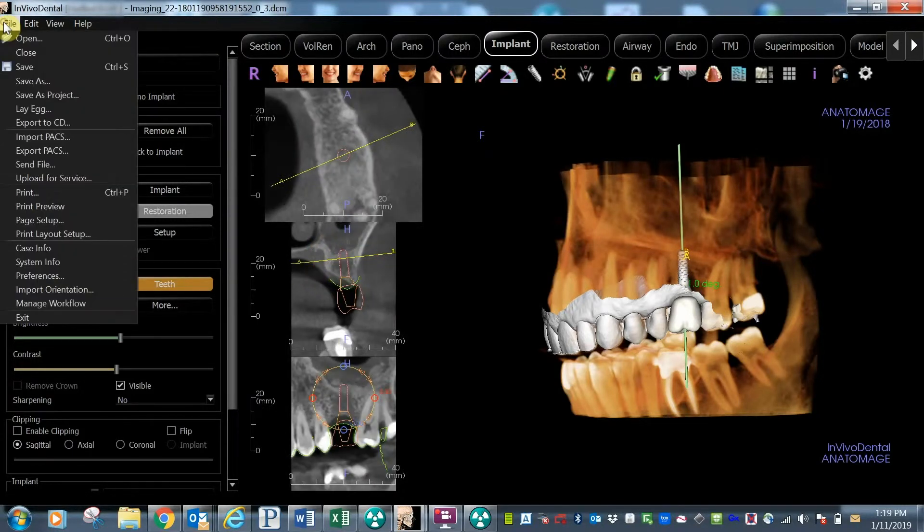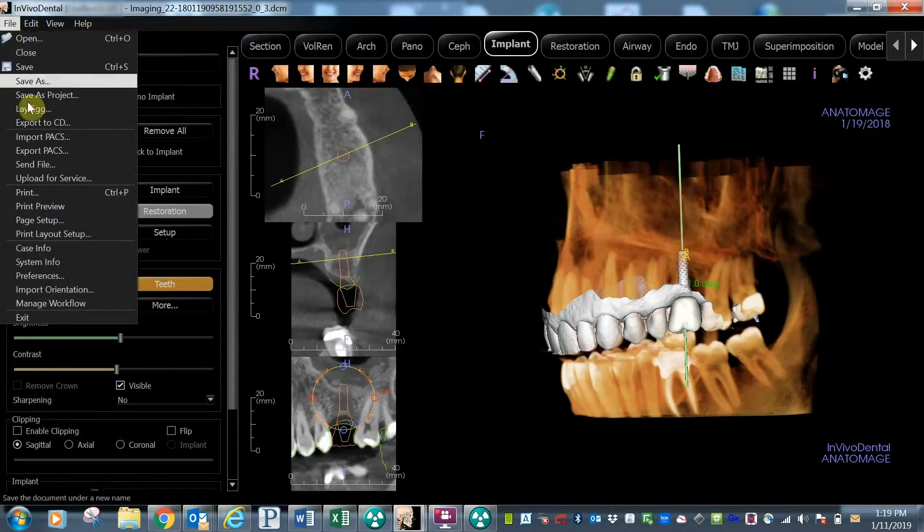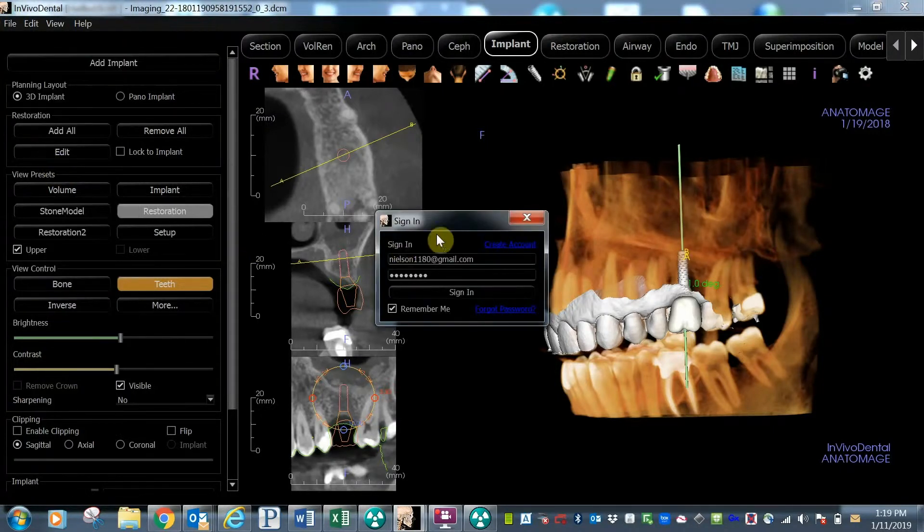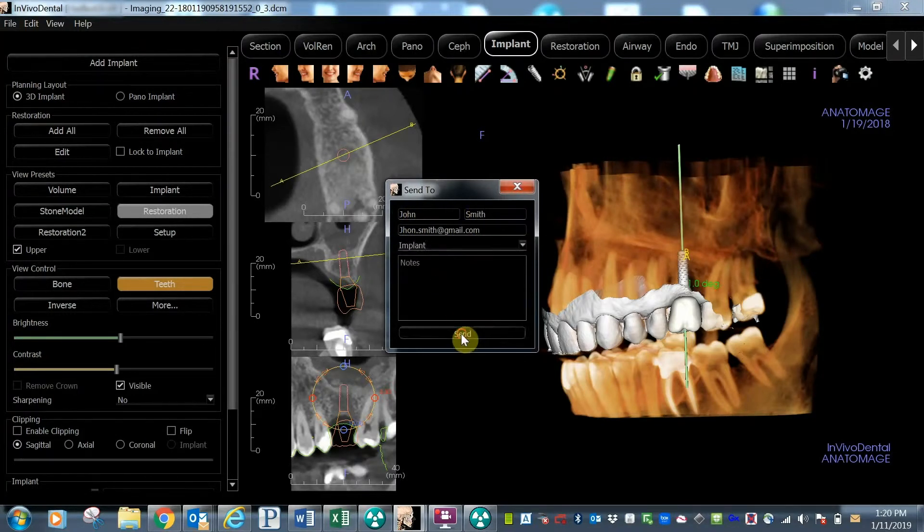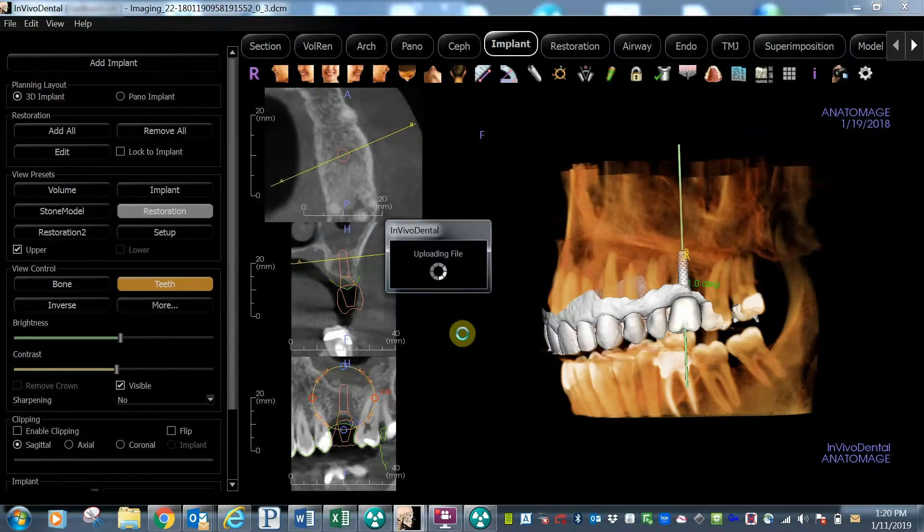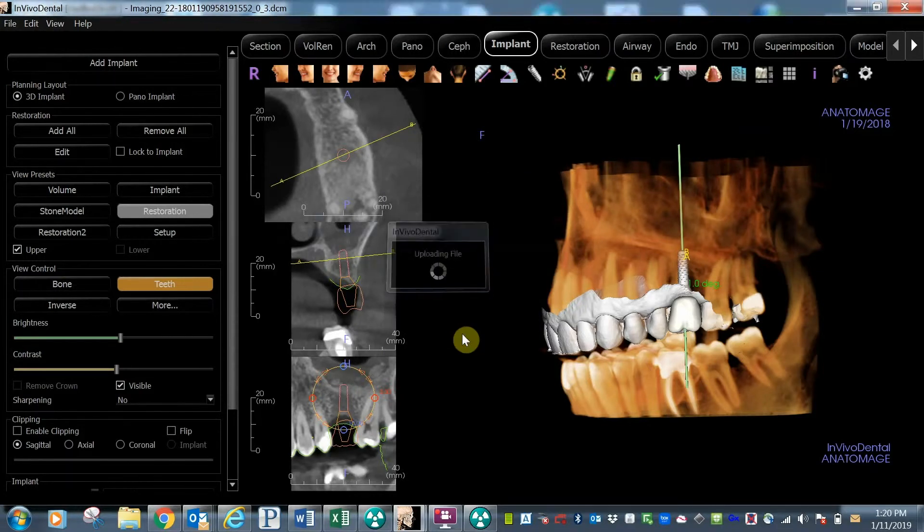You can also easily share cases using the cloud service feature of Anatomage. Simply upload the case to your cloud account. Then, enter the contact information of the person with whom you want to share the information.